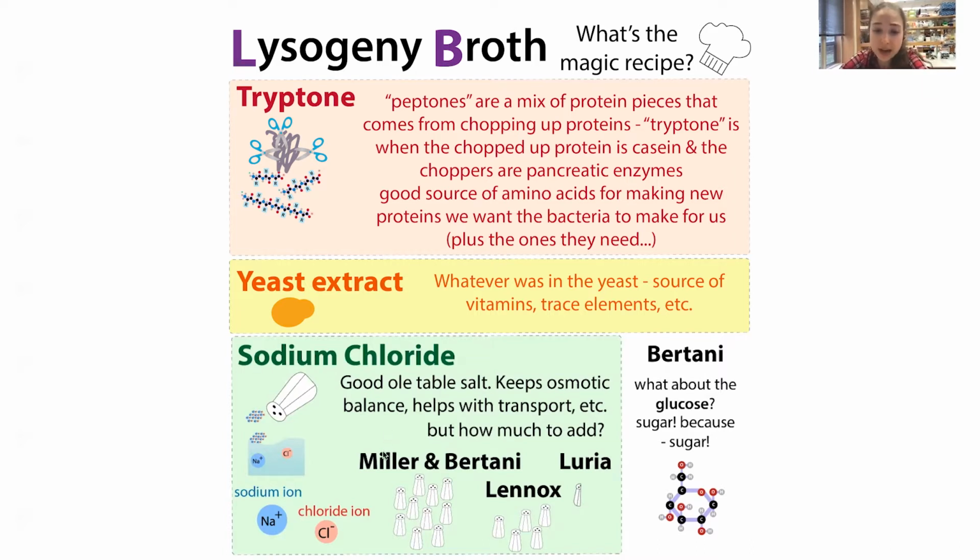So Miller is this guy who just basically wrote this textbook with all these recipes. And so he put in the recipe for the LB and kind of got credit. But really it's Bertani that is the person that we really have to thank for this. And he called it lysogeny broth.